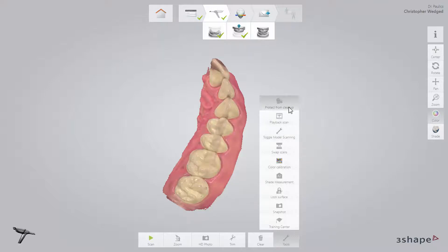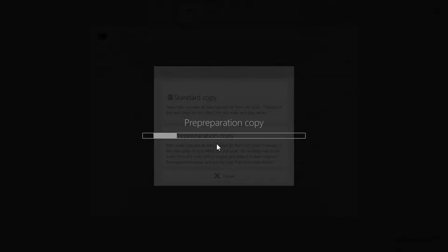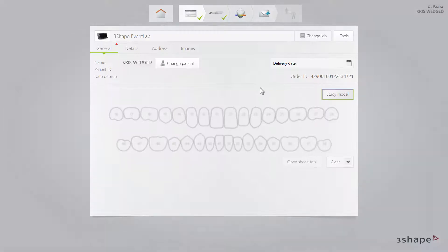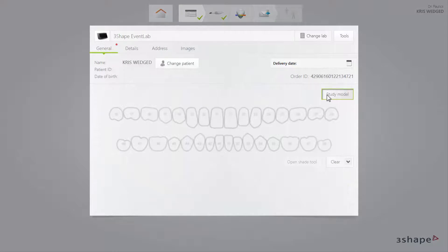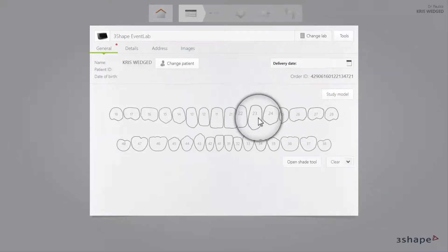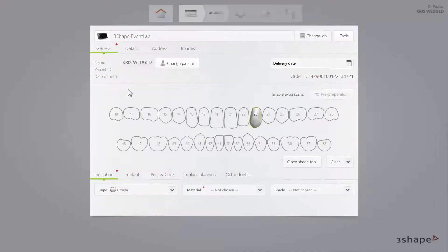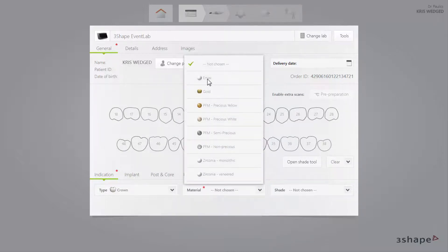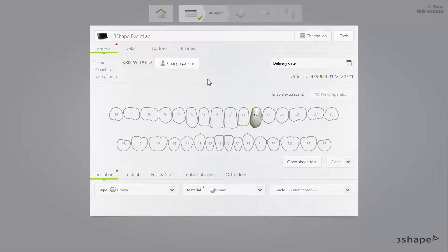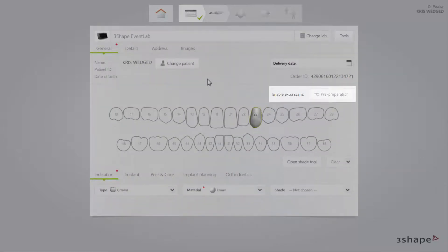This will tell Trios not to clean up the case, and you will be able to continue to use the case for pre-preparation for extended periods. On the order form window, select the tooth to be restored, restoration type, and material in the usual manner. Notice that because the pre-preparation copy has been selected, the Enable extra scans option is greyed out, and the pre-preparation button cannot be selected.